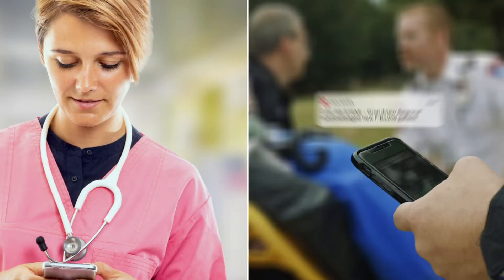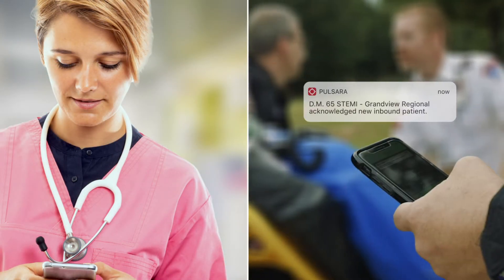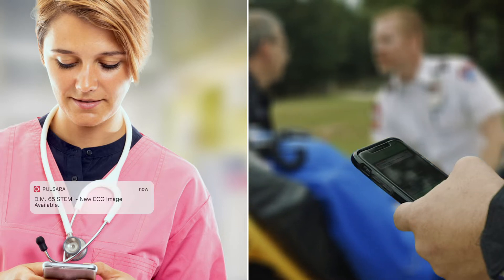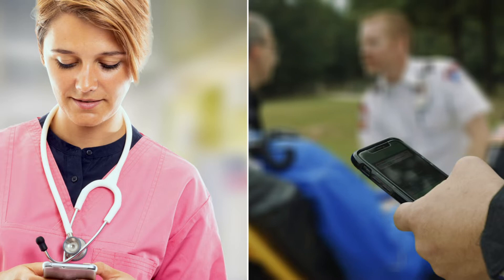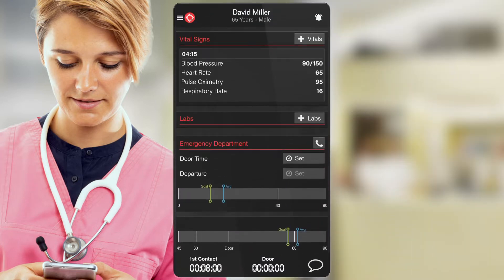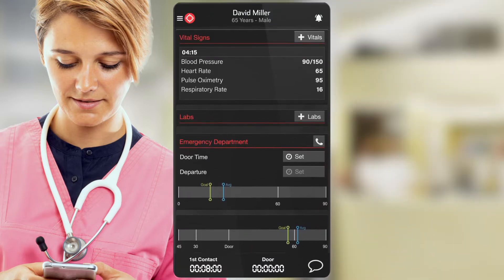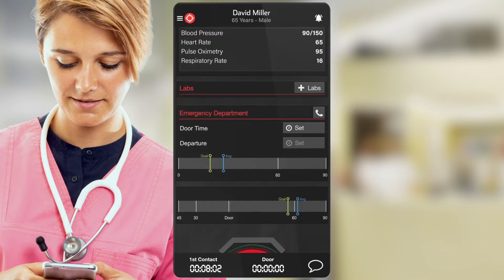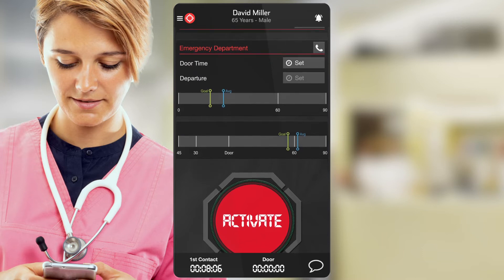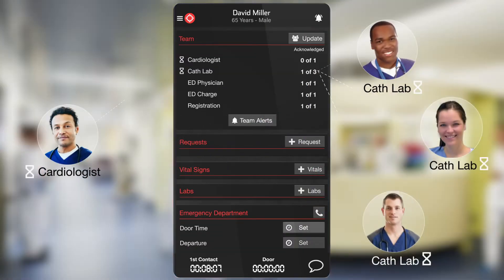EMS receives a notification that the hospital is aware of the critical inbound STEMI patient, as well as confirmation the ECG has been received. Pulsara assists with STEMI inbound workflows to help protect utilization of expensive resources. When the hospital is ready to activate their full STEMI team, they can do so with a single tap. Again, this care team is fully customizable to hospital resources and preferences.